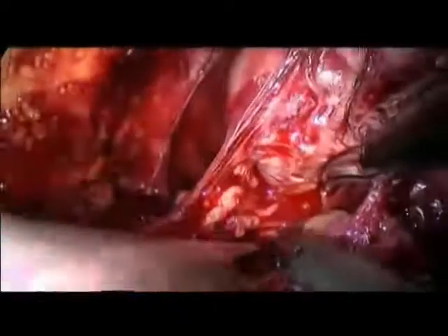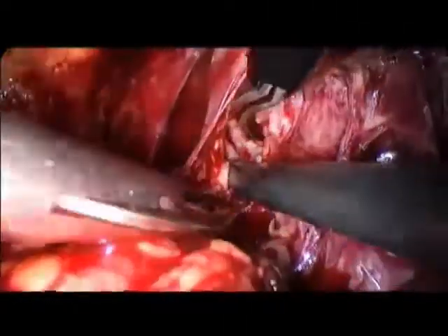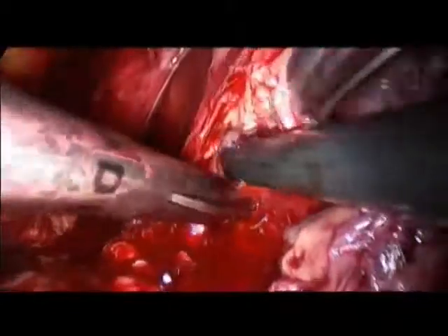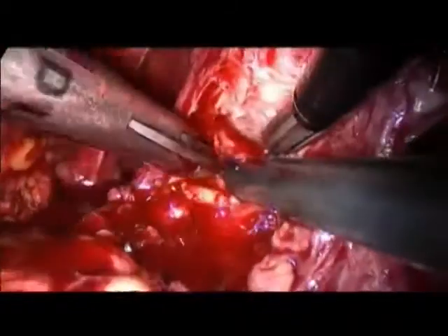You see that we didn't divide the prostatic visceral fascia on the lateral aspect or even on the anterior aspect. We keep the coverage with the fascia on the lateral aspect.